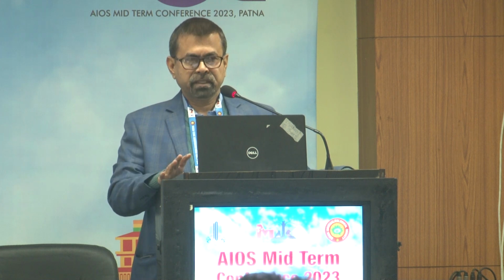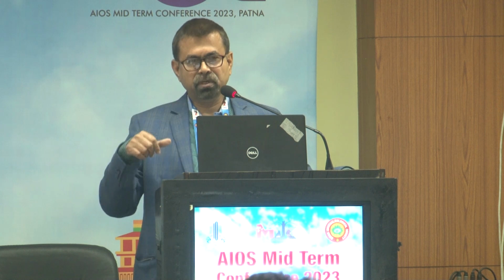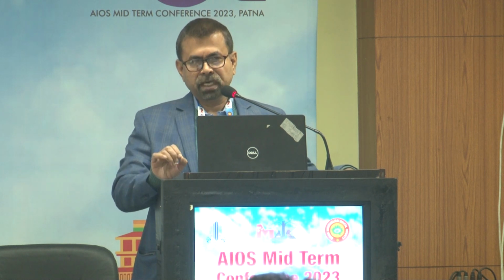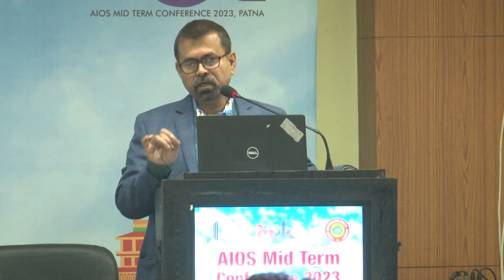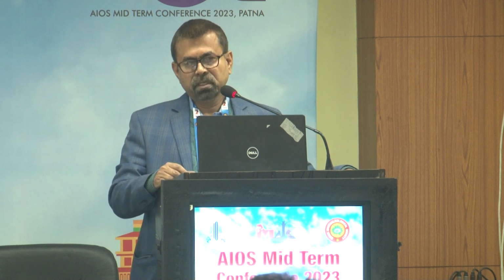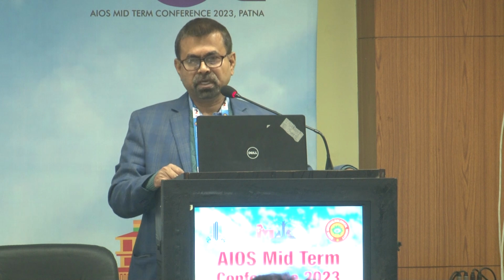In Morgagnian cataracts, you don't need to do a mini rhexis. You can aspirate and you can do an optimum size rhexis in one go. But in intumescent cataract, it is always safer to do a small rhexis first, aspirate some cortex, make a nick at the margin of the mini rhexis, and then do the optimum size rhexis.